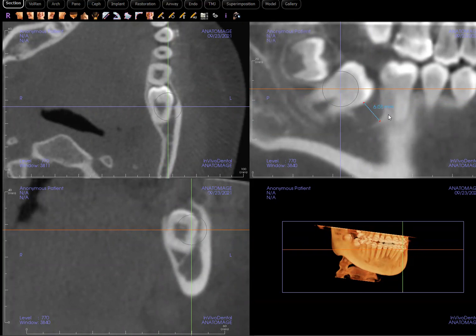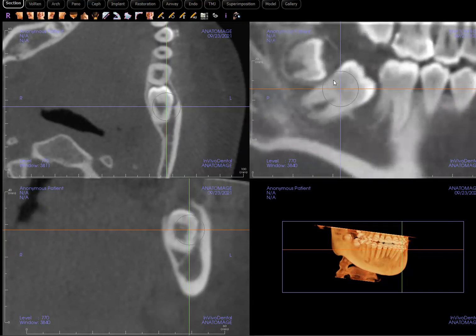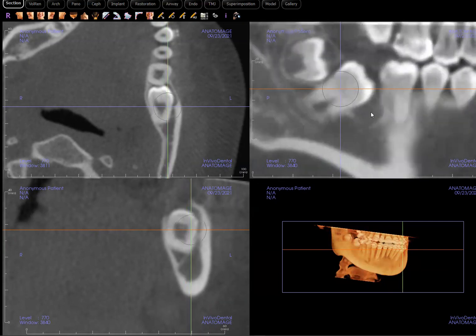Obviously I already know the diagnosis, and so do you. But if we didn't, that six millimeters would certainly be worrisome. Based on the textbook, about five millimeters is the cutoff between a normal and a hyperplastic follicle. Once it becomes greater than five millimeters, I can't completely rule out a hyperplastic follicle, but I'm really starting to lean toward a dentigerous cyst. Also, the shape of the expansion is very helpful — hyperplastic follicles show a generalized enlargement, whereas here we have this asymmetric enlargement of the follicle.